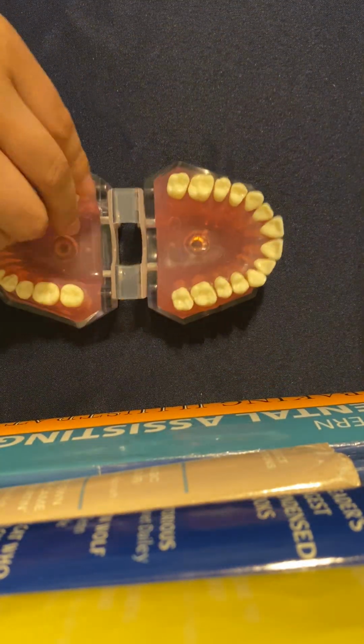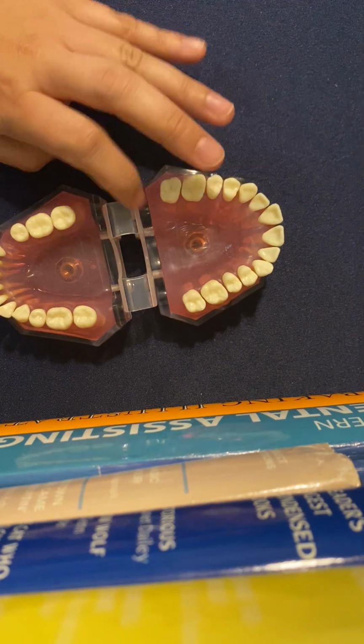So, yep, that about does it. One through 18, how to do a full mouth series.